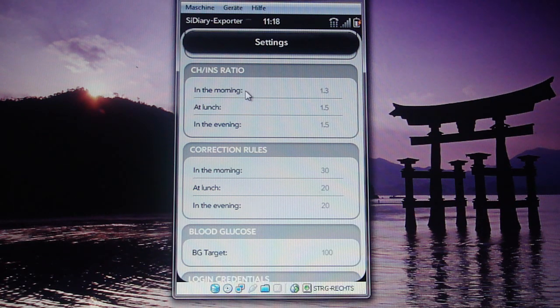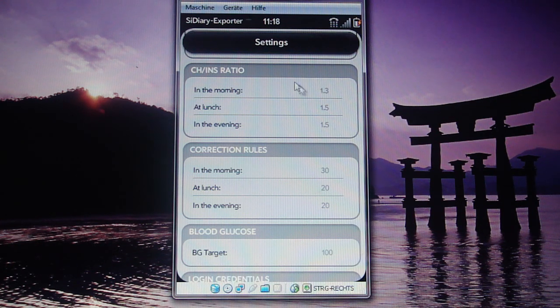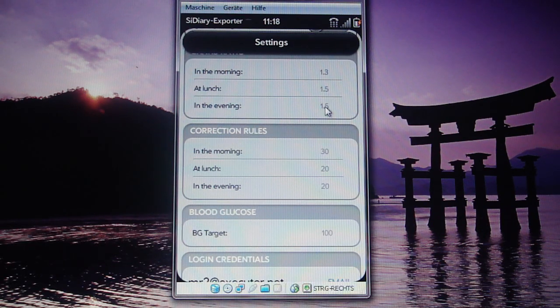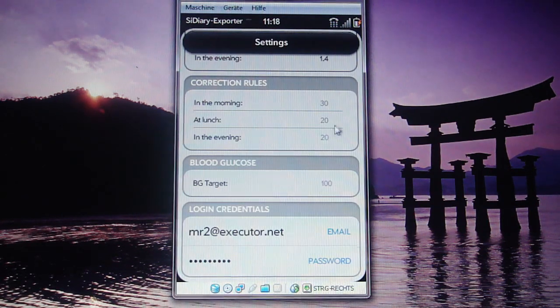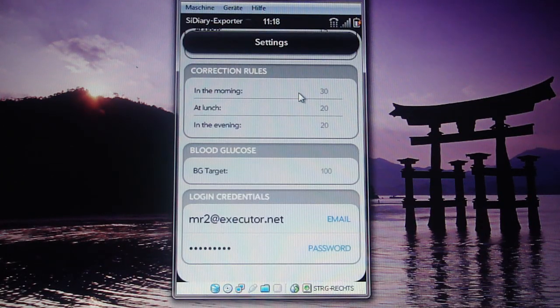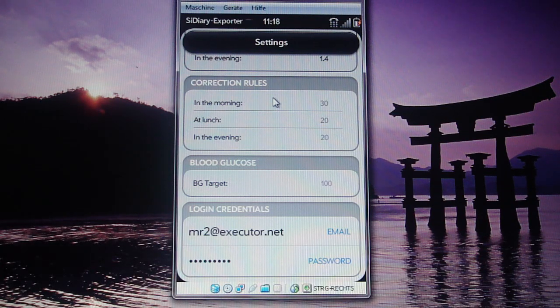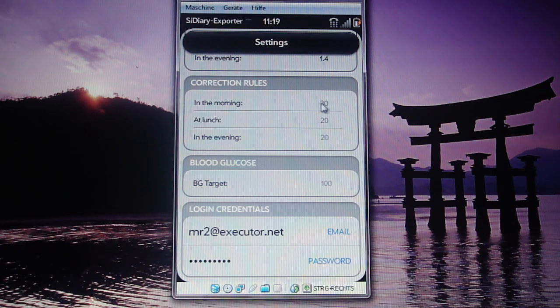Next is the correction ratio — based on when you eat, how many BEs are transferred and what you need to recalculate into insulin. For me it's 1.3 in the morning, 1.5 for lunch, and 1.5 in the evening. You just hit the number and enter a different value, hit OK, and it's saved. The same applies to correction rules: if your blood sugar is not within your target range, this sets how many units of blood sugar require one insulin unit.